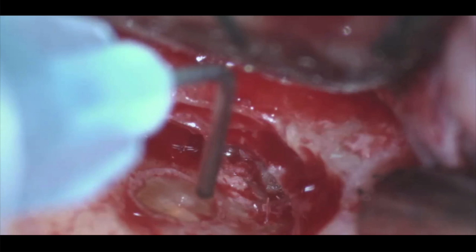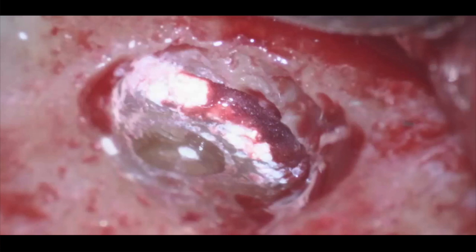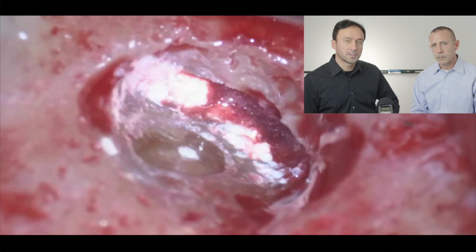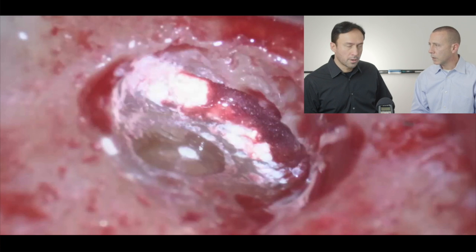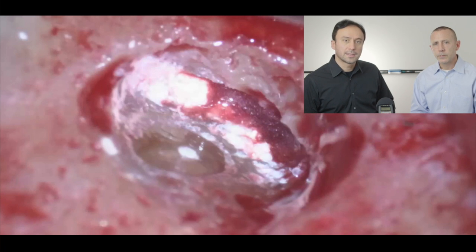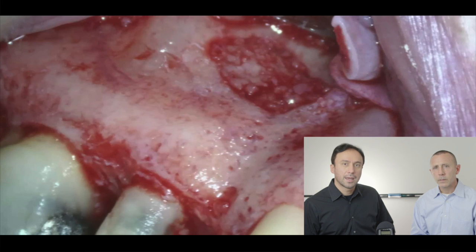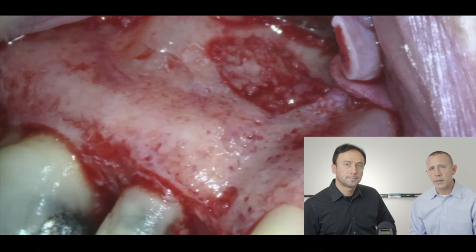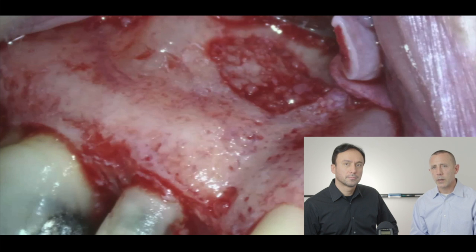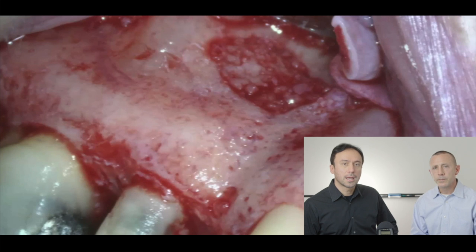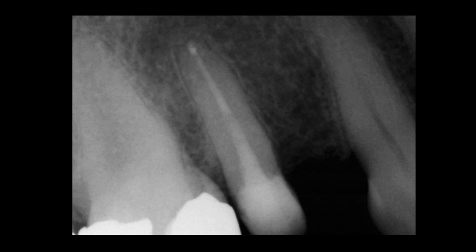The opening wasn't quite ideal to get the full length down. After injecting the bioceramic, the putty material is placed as a cover. There is a little bit of flash on the side that is easy to clean using a spoon or by hydrocarving with a little water — it comes out easily, giving a nice seal right at the apex. Demineralized bone was placed in there and covered with a resorbable membrane, then suturing was completed.